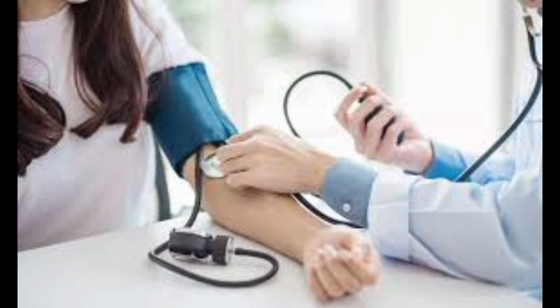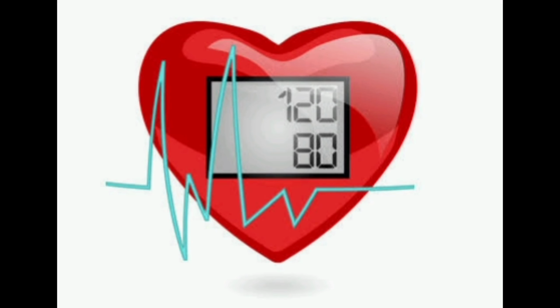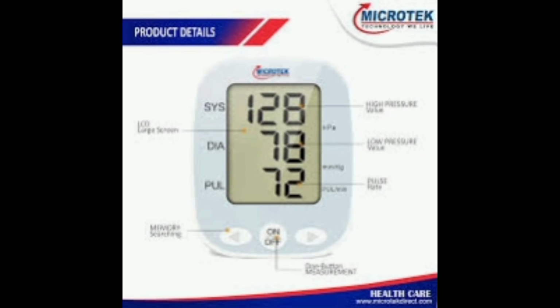Gently keep reducing the pressure with the valve on the sphygmomanometer bulb. Now you lose the beat. It is the diastolic pressure. For example, you start to hear the beat at 120 and you lose the beat at 80. Now you can tell your BP as 120 by 80 mm of Hg. Nowadays, blood pressure monitoring is very easy with a digital BP apparatus without a stethoscope. Simply tie a BP cuff on the arm and press the start button. Then it automatically shows the BP on the display.